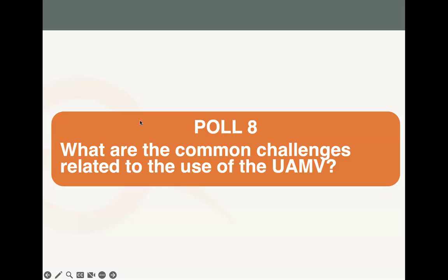For that to be calibrated as advised, because remember, all the volume changes within the patient, such as the minute ventilation that the vent measures, and the pressure changes that the vent measures, are a result of the information passing through the flow sensor.